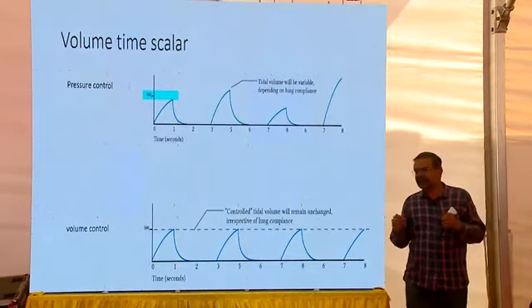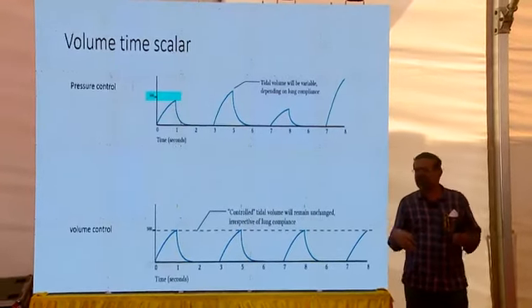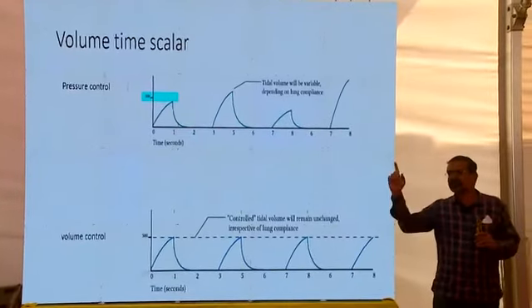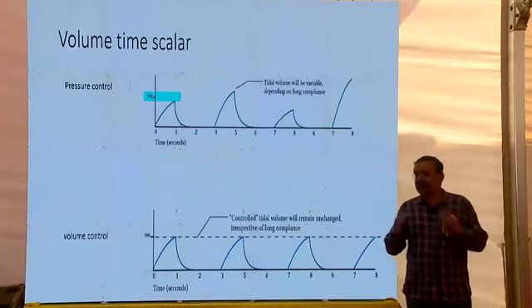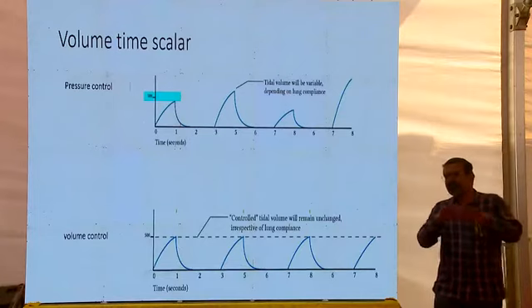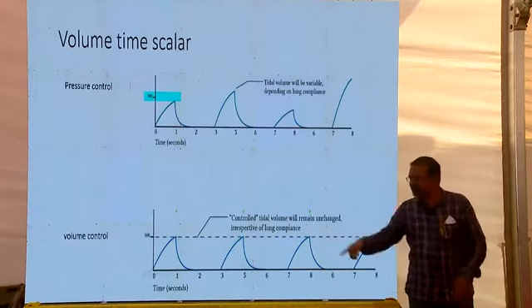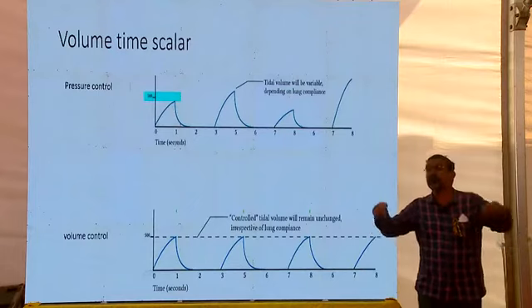For pressure, the typical baby is a tough ventilation, white lungs, pulmonary hemorrhage, pneumothorax, severe collapses, atelectasis happening. This is pressure. Oxygenation problem, pressure. Developing severe RDS, pressure. Surfactant failure, pressure. So these are the typical, there are two different situations, and they are overlapping. But once you understand that, one baby can be on pressure sometimes, on volume sometimes. The percentage can change depending on your demographics.